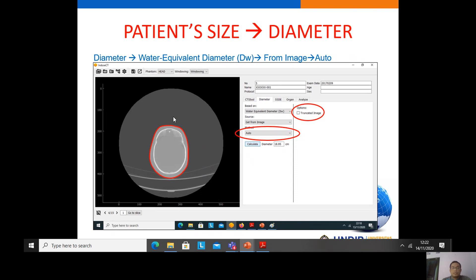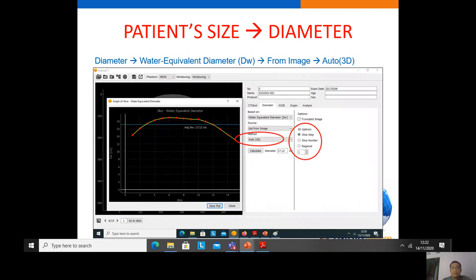If the image is truncated at the edges, we can select the truncated images option, and the software will compensate for the truncated images to get a more accurate water equivalent diameter. Using auto 3D, we also have three options: slice step, slice number, and regional, to calculate from one slice to another. A curve shows the water equivalent diameter from slice 1 to slice 15, and we can save or export it to an Excel file.